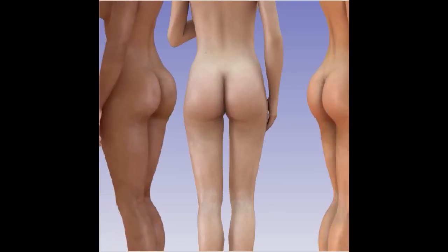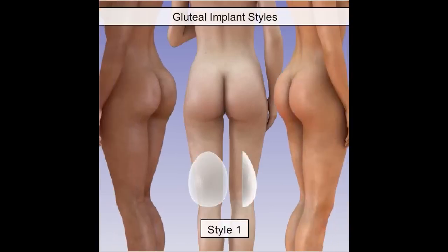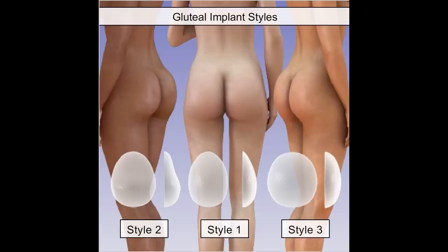Your physician will help you choose the style of implant and surgical technique that will best achieve the look you are after. It is important to keep in mind that implant size is limited by your anatomy. Depending on the tightness of muscle or tissue that will surround the implant, the thickness of the style you desire may need to be adjusted during the surgical procedure. Your physician will use the best option to achieve optimal results and facilitate proper healing.